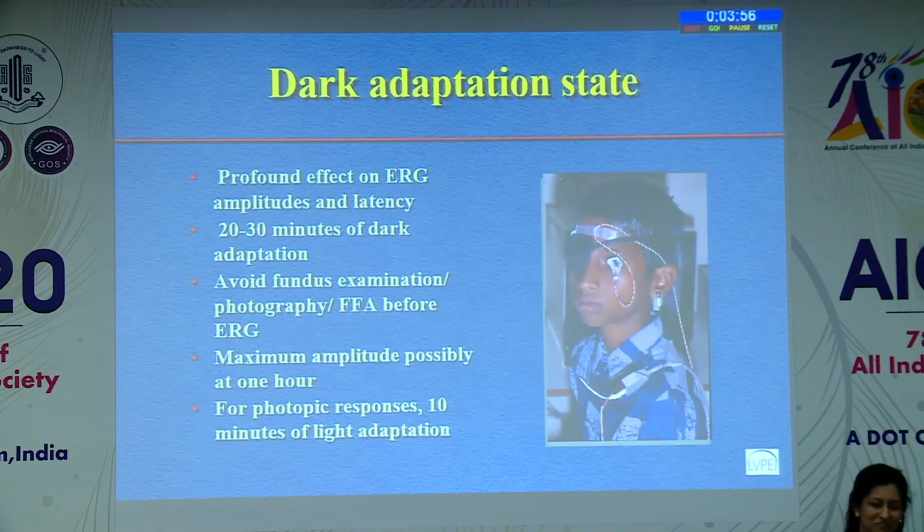Dark adaptation state, again, some people try to do shortened dark adaptation. Especially if you've looked at that retina with some imaging device, like FFA or light-based systems, then the ERG is going to come different.